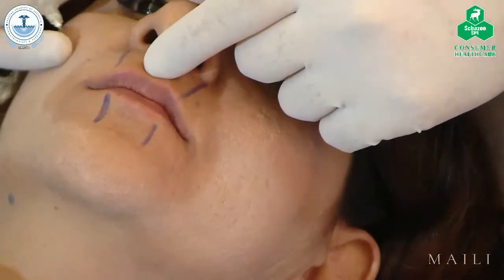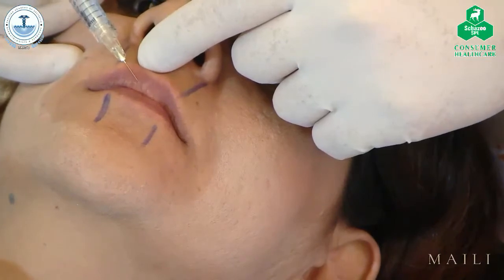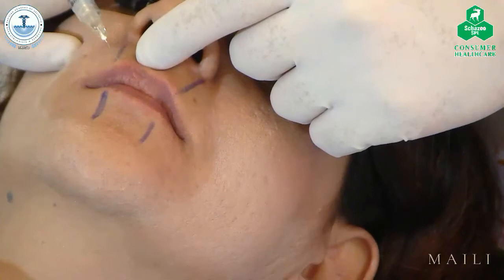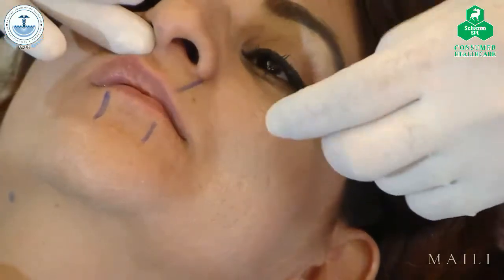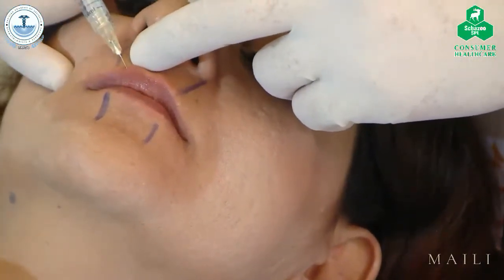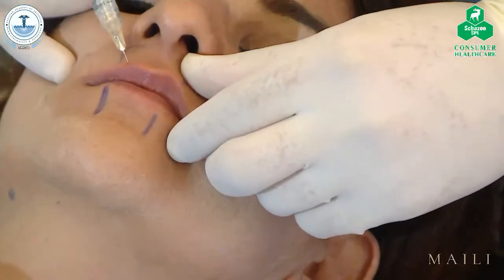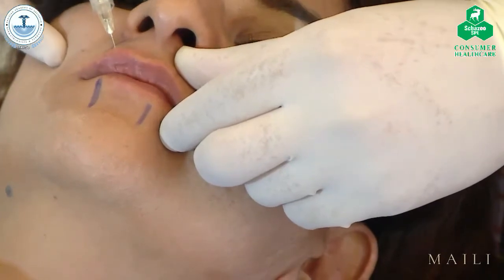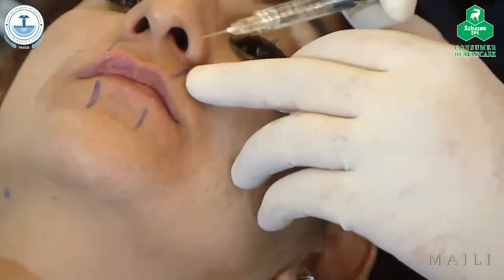So what I'm going to do is go from outside the skin, and my filler is going to look exactly like that inside. I'm going to go in and in and in. I'm going to give 3 lines as I showed earlier. So this is how it's going to look from the inside. I'm not going to give it too superficial, and I'm going to give 1, 2, 3. I'm going to do the exact same thing on the other side.